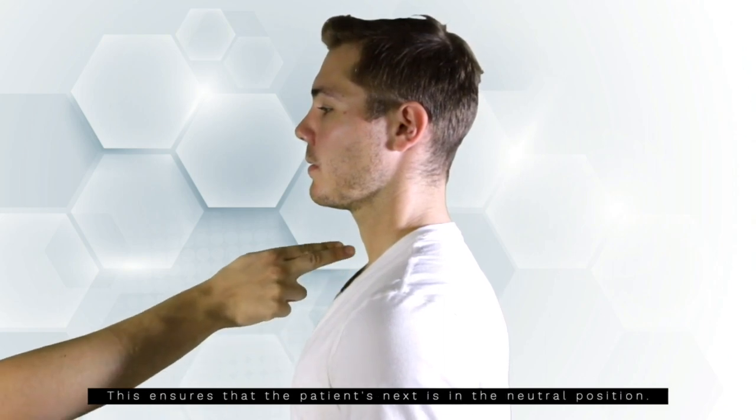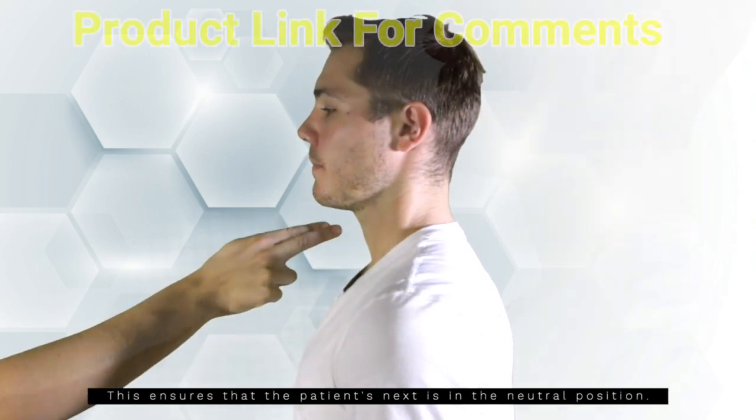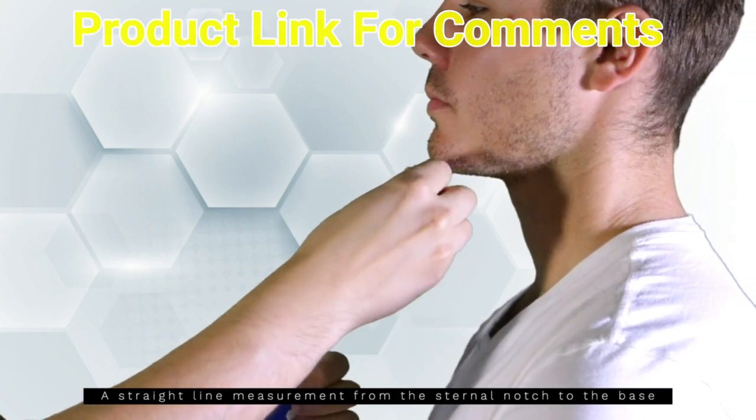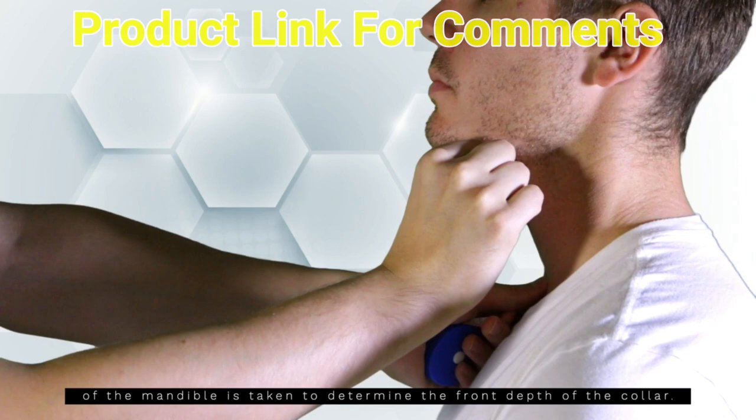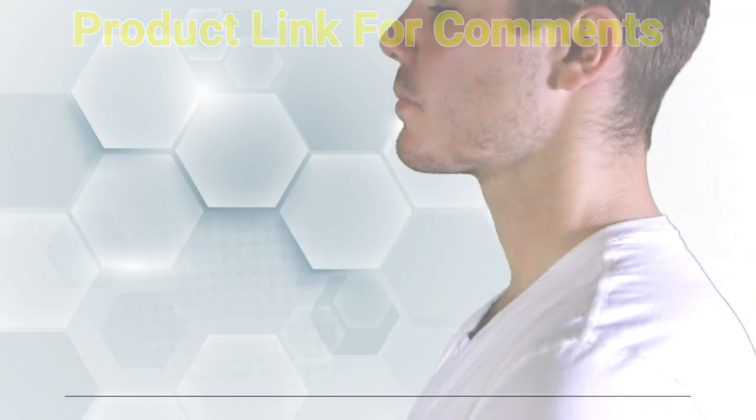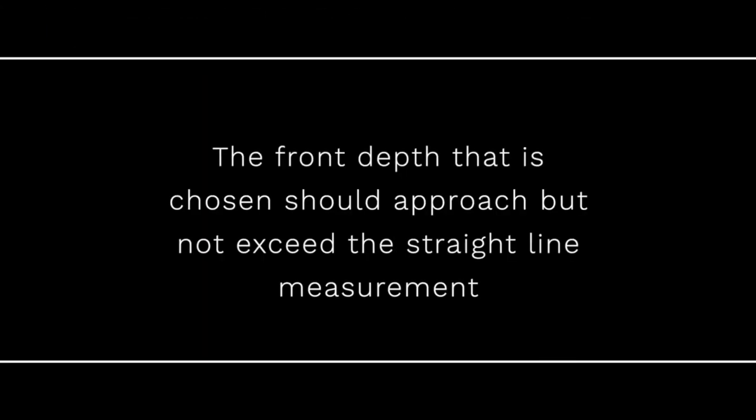This ensures that the patient's neck is in the neutral position. A straight-line measurement from the sternal notch to the base of the mandible is taken to determine the front depth of the collar. The front depth chosen should approach but not exceed the straight-line measurement.